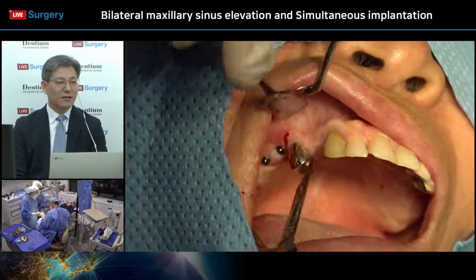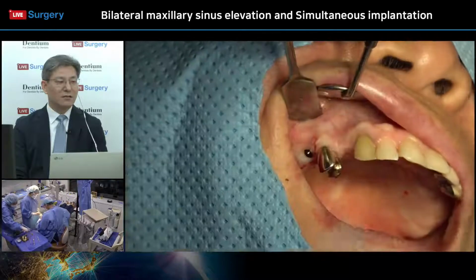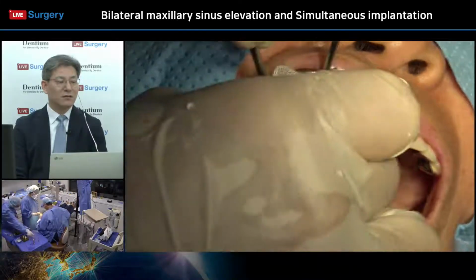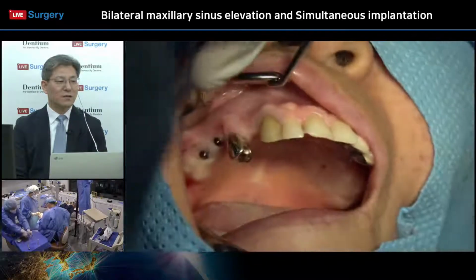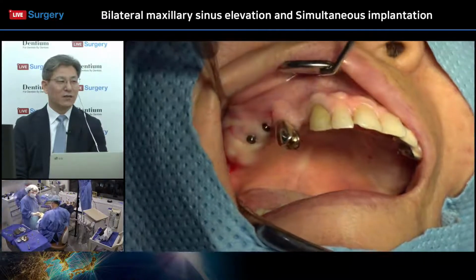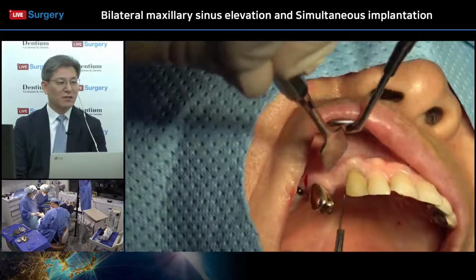It has some head. Done in the 16. Yeah. And without any vertical incision and vertical sutures, and with pressure, it controls the bleeding. Okay, and the flap adaptation, everything is very well done. Very nice. And after that, move to the 14.